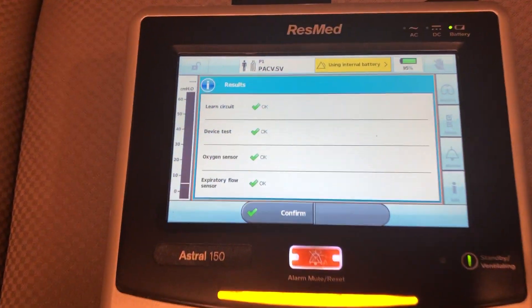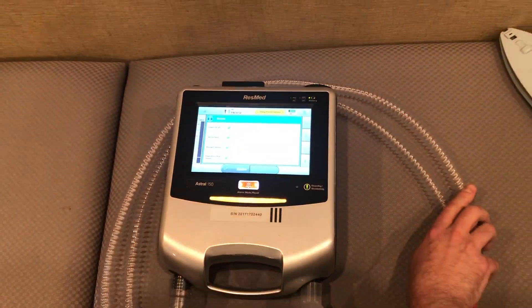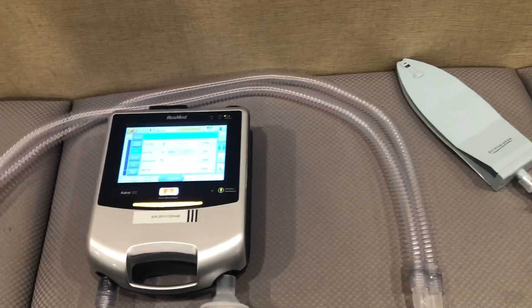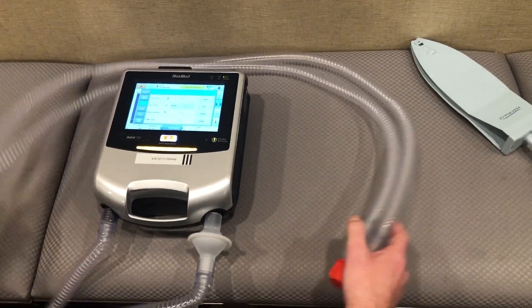We passed all of our tests. So now we press confirm and we're going to go into our menu and set up the mode of ventilation that we want to use on this patient.